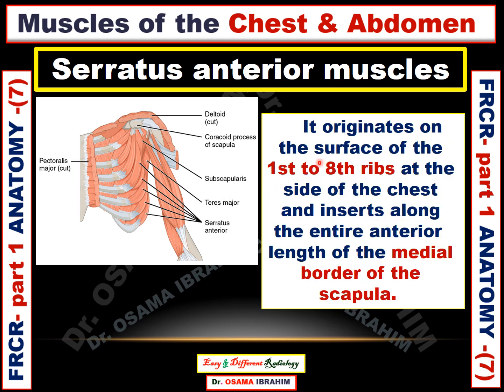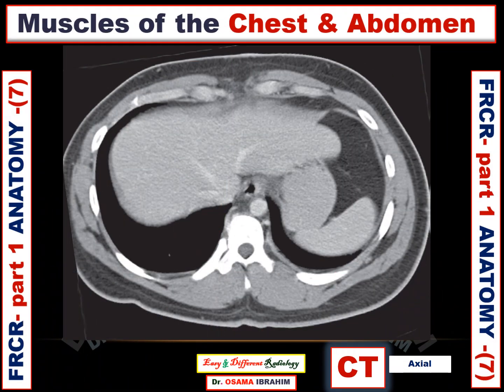The serratus anterior muscle originates from the surface of the first to eighth ribs at the side of the chest and inserts along the entire anterior length of the medial border of the scapula. Let us see it in the CT — this is a CT axial image, post-contrast study, as contrast is showing in the aorta and also in the hepatic veins in the portovenous phase. This arrow refers to the serratus anterior muscle on the left side.